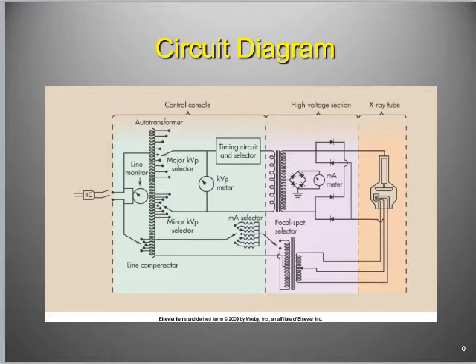call a rectification circuit, or I don't know what we're going to call it, the rectification diamond. It's always drawn as a diamond. And these little symbols inside the diamond are diodes, right? Now, we talked a little bit about diodes. We said the X-ray tube is actually a diode. And all you need really to know about diodes is that they only allow power to flow in one direction.